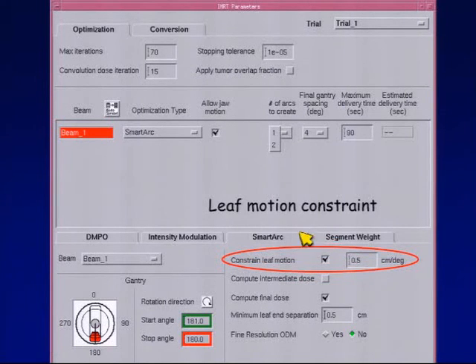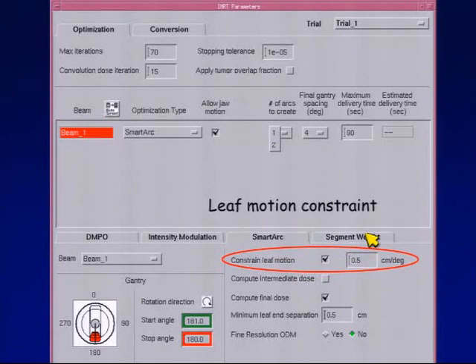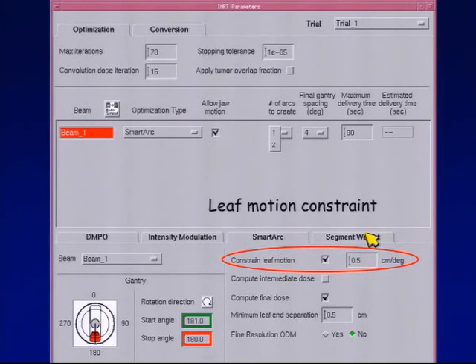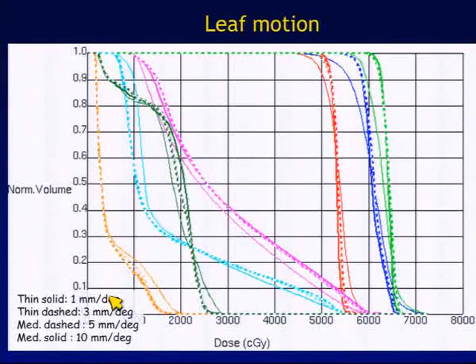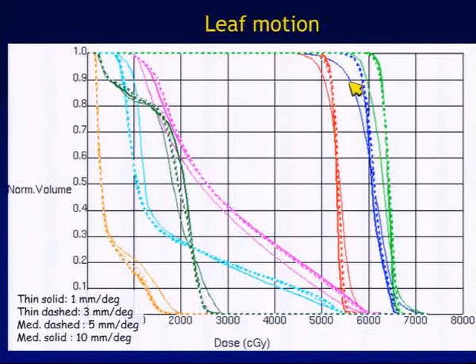Another parameter in Pinnacle is constrain leaf motion — for example, 0.5 cm per degree. This impacts how much the leaves move from one beam angle to the next. If you let the leaves move dramatically from angle to angle, you get more intensity modulation but it takes more time to deliver. Testing values from 1 cm down to 1 mm per degree: if you allow only 1 mm of motion per degree, you're essentially forcing it toward dynamic conformal arc therapy rather than true VMAT, and that's where you start to see some loss in plan quality.